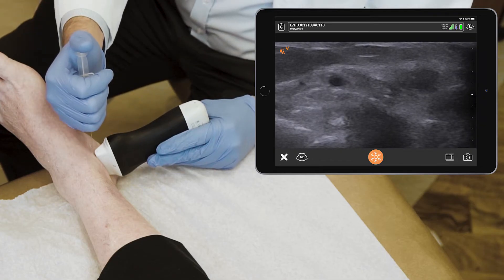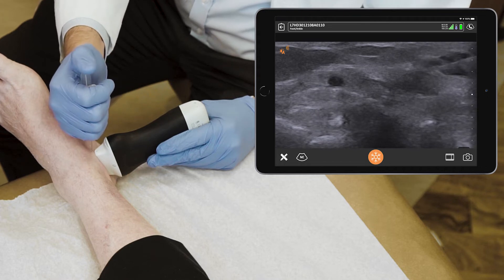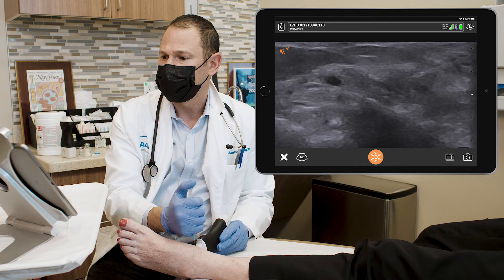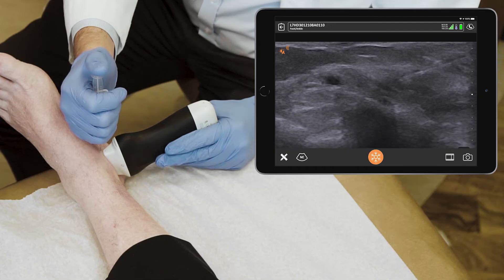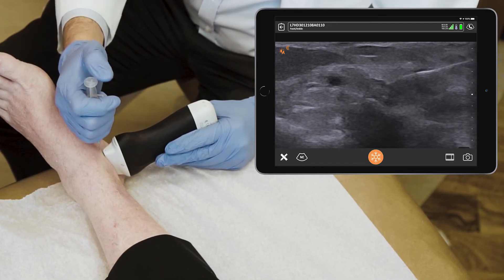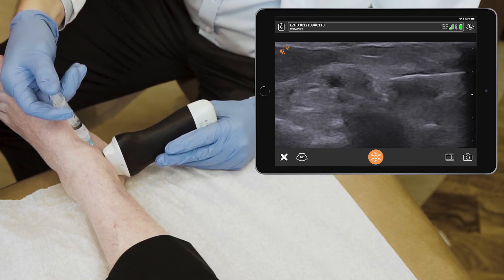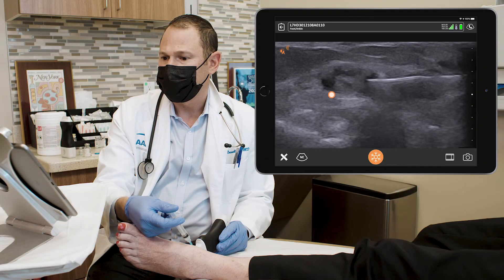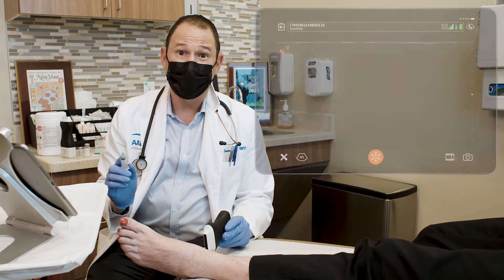A little pinch. Anything that shoots to the toes, let me know. I'm in the tunnel now. And I'm injecting around the artery — the nerve is next to the artery. And we're done.